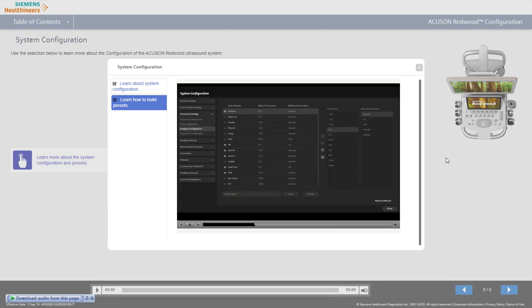Let's now create a preset together. In this scenario, we have a user who prefers the current abdomen setting when imaging kidneys. They would like a customized preset to perform difficult renal exams. They also prefer the 4v1 transducer in order to reduce rib shadowing artifact, but would like to be able to easily switch between the 5c1 and the 4v1 transducer.